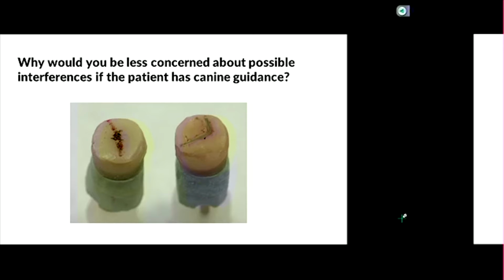No, you're doing great. Then in the patient's mouth, if you err towards shallow, hopefully they're a little bit more steep than that, and then you'll be good. There won't be interference. Okay, so if you didn't catch that, that'll be replayed on Echo 360. I think that's right, yeah.